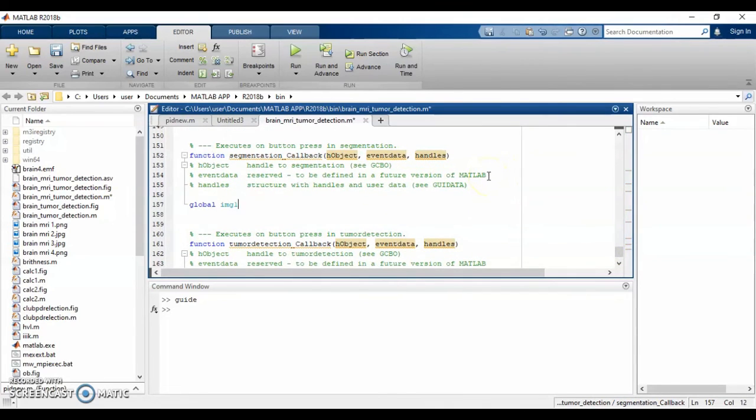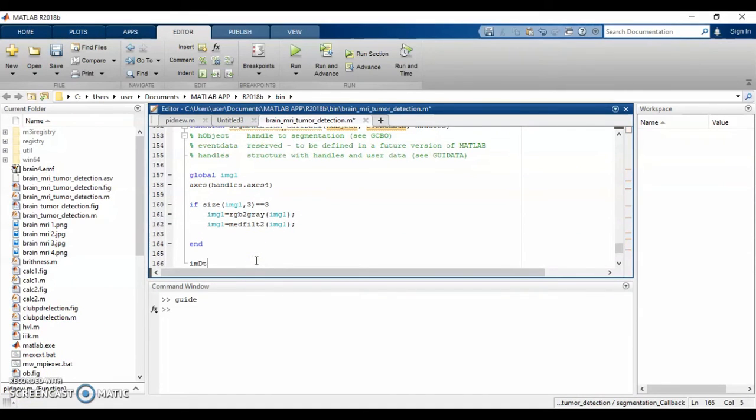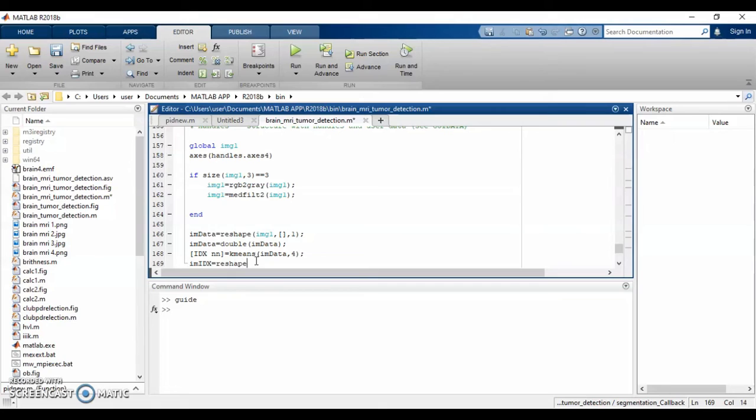So the fourth push button will be used for segmentation. Similar to before, we have to retrieve the previous image again and type the command to make it appear in axis 4. Then the median filtering function will be applied. So in this project, we will use the k-means clustering algorithm for segmentation, and the following is the script for the k-means clustering algorithm. This algorithm will cluster or partition the given data into k clusters or parts based on the k centroids. The algorithm is used because we have unlabeled data.